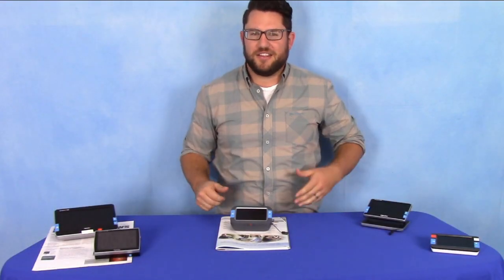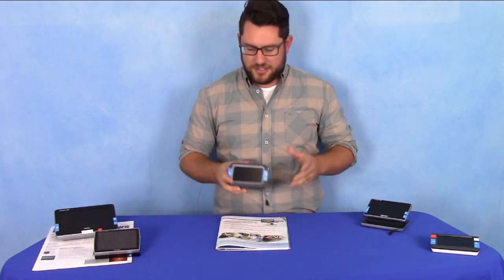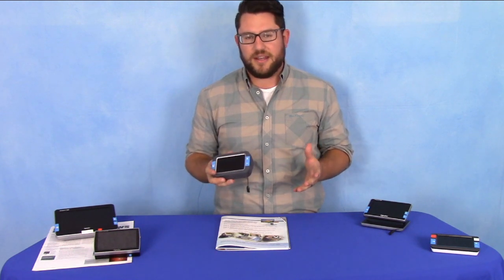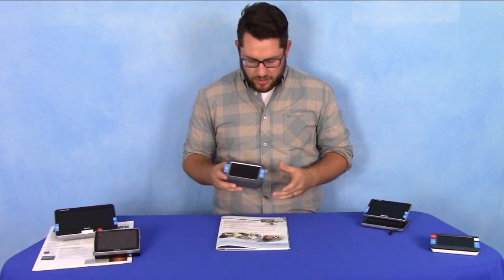Hey guys, Tyler here from Optelec. Today in this short video I want to show you a quick snapshot overview of our Compact 4 HD. This is one of five in our Compact HD line, featuring a four-inch screen.